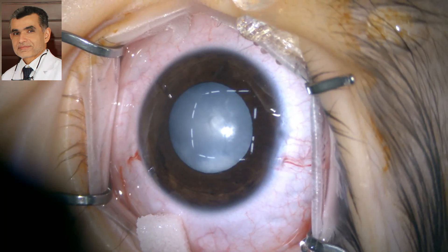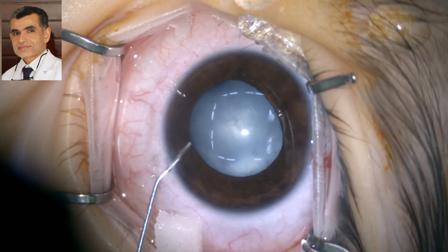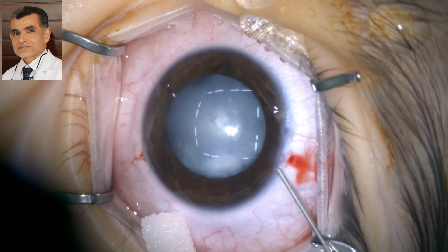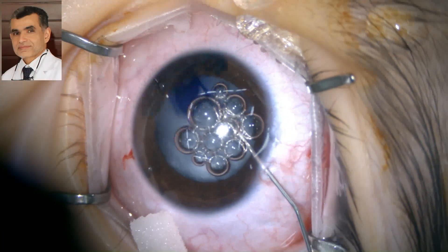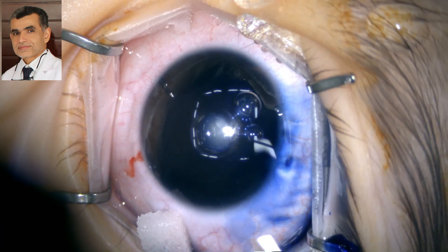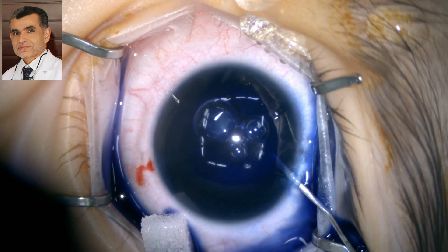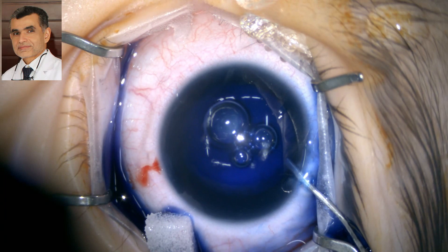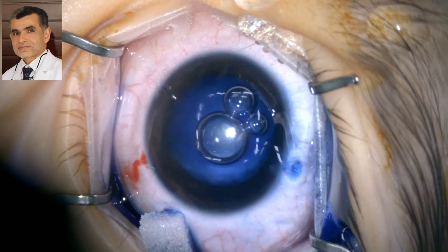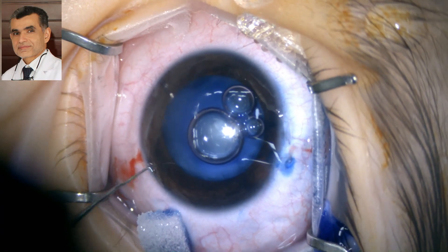This is a young patient, two years old, with a white cataract. The etiology is not known. Leucocoria was discovered one month ago and she was told she has cataract. No history of trauma could be elicited. The other eye lens was quite clear with no problem. She had normal labour, no intrauterine infection, and no family history of any problem.